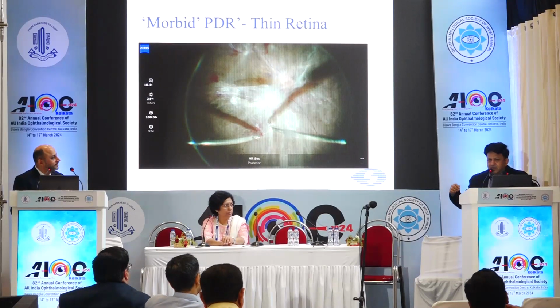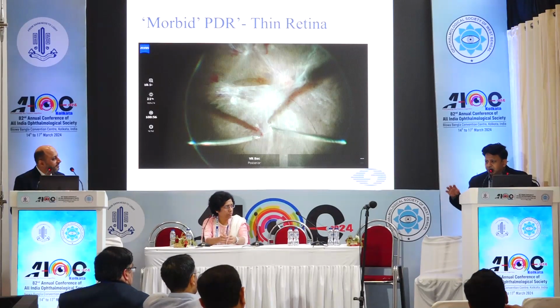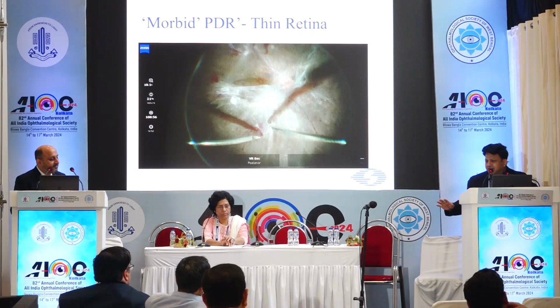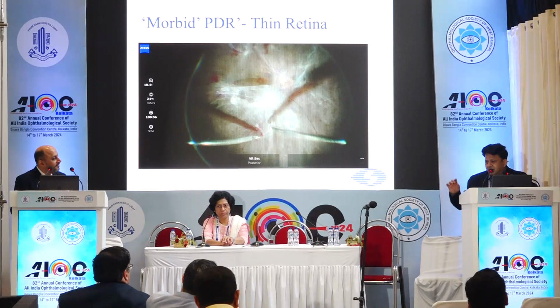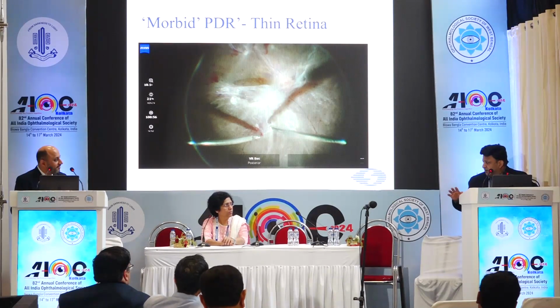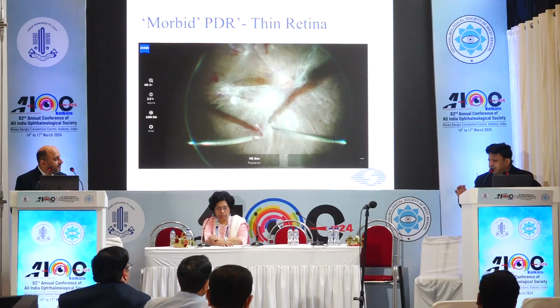For the unimanual technique, how much to pull for beginners, I would advise that if you feel you can pull, just try once and then leave it. As soon as the membrane separates from the disc, just leave it, right? And if you're not able to do it the first time or the second time, just leave it and do the other way. In the beginning, I would just advise this. But most of the time, as I said, it is not difficult. It doesn't bleed, it doesn't cause tears, and the dissection in almost 90% of cases becomes very, very easy.